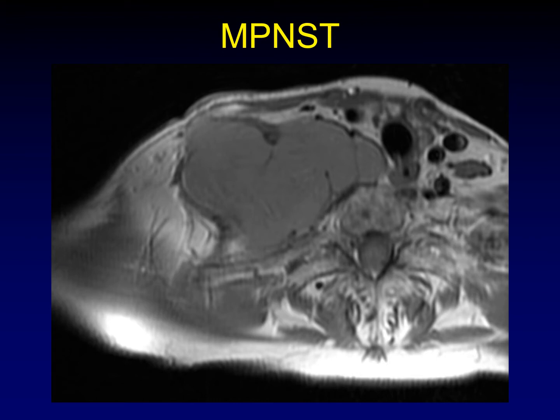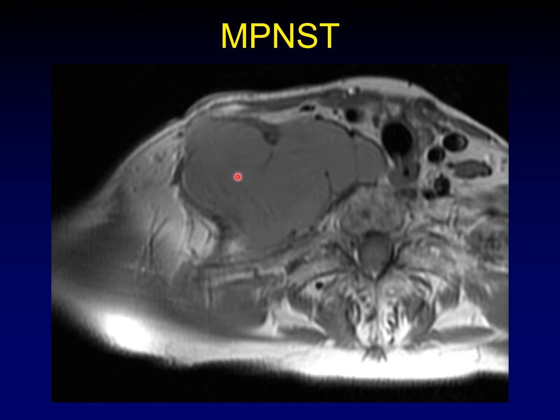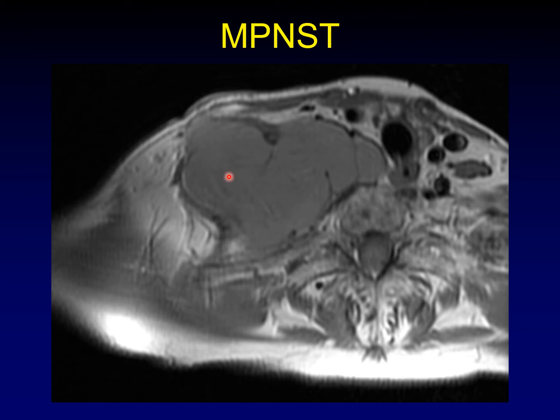How are we going to put a differential diagnosis on this? On the proton density sequence, the object indenting the front of this huge mass is the anterior scalene muscle. This hugely widened area is the scalene triangle, and this well-defined uniform mass is running right through it. By recognizing the anterior scalene muscle and confirming anatomic orientation on sequential images, we know this runs through the scalene triangle. For an enhancing mass in this location, it's going to be a nerve sheath tumor. There's nothing that would allow you to determine this was a malignant peripheral nerve sheath tumor — it had a fast rate of growth that clued us in, but it looks just like a schwannoma of the brachial plexus.